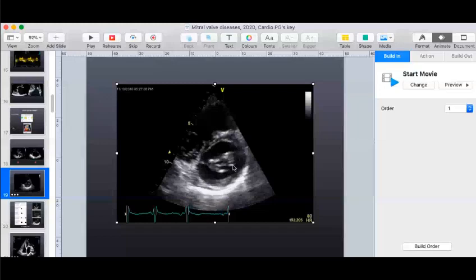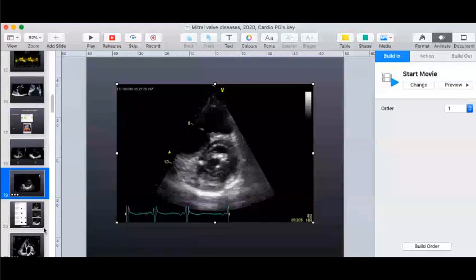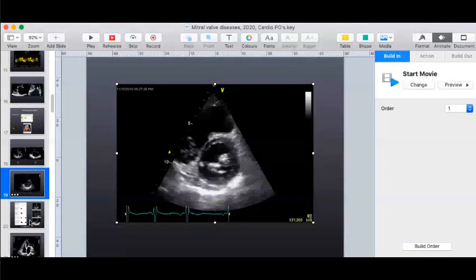Can you put in a little more description into your commissural calcification? Anybody? So unilateral or bilateral commissural calcification? Right. So there is unilateral, unicommissural calcification.